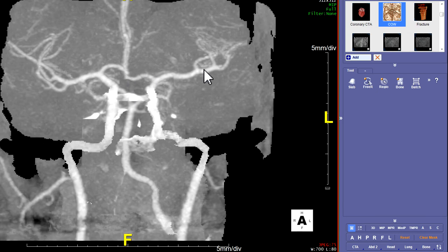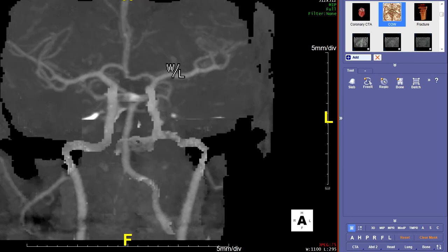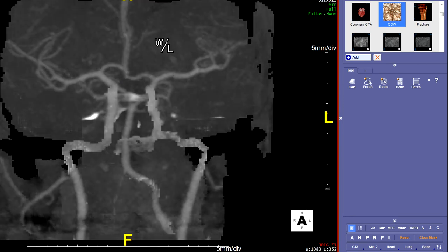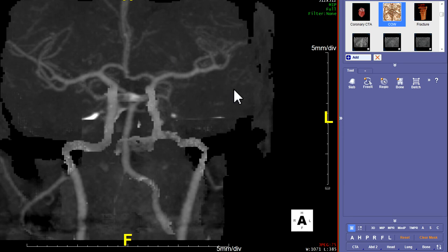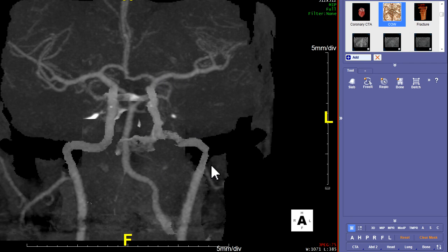The windows aren't great here, so down here on the CTA presets, those are usually pretty good. Click on the little tab that says CTA at the bottom right, and it gets pretty close. Now let's window and level that and just tweak it to make it as good as possible. You want to emphasize — always when you're trying to window — look at this middle cerebral artery and make that show as good as you can. Now I think we're ready to film this out.